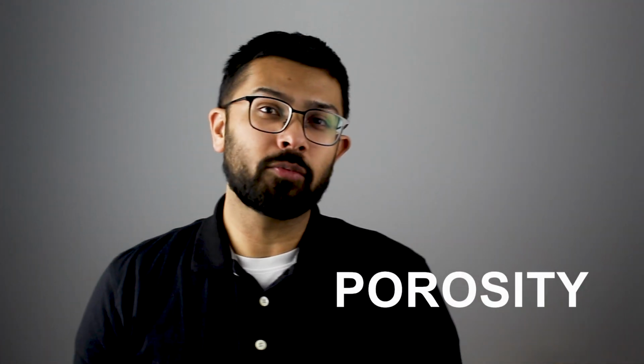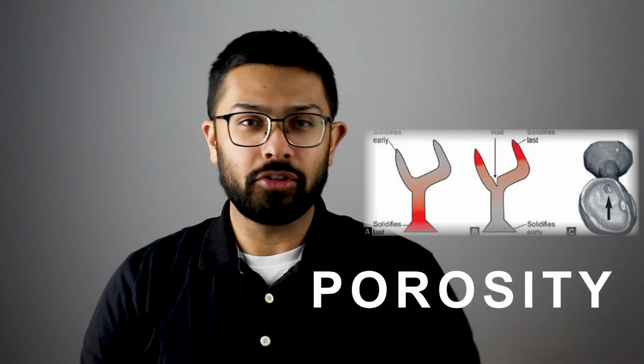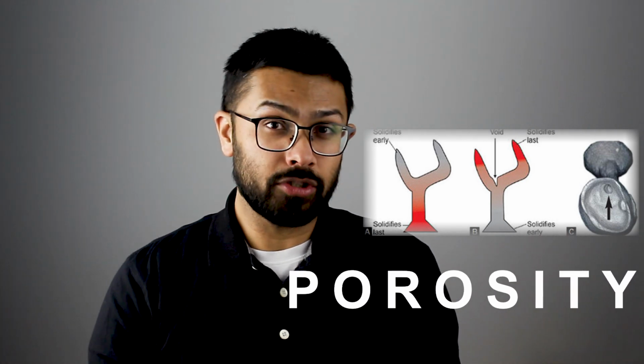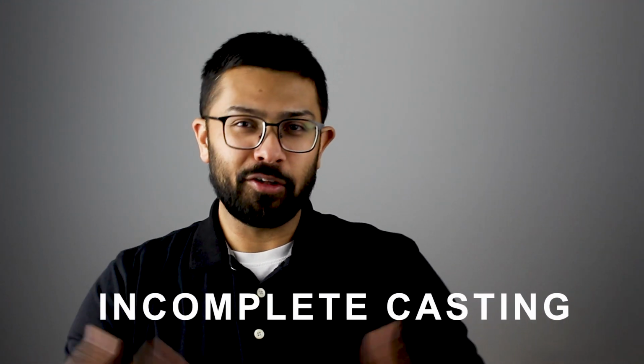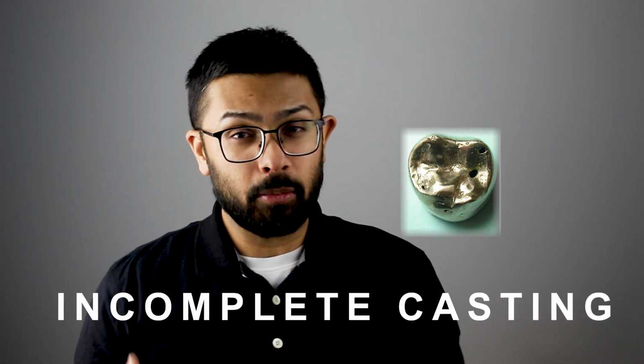So the first one is porosity, which is caused by gas entrapment or shrinkage of the metal during solidification. Prevention is to ensure proper temperature control is taken care of and the use of proper degassing techniques. Then the next defect is incomplete casting. The metal does not completely fill the mold, often due to incomplete wax elimination or improper metal flow. The prevention for this defect is to use a proper spruing design and ensure adequate burnout.